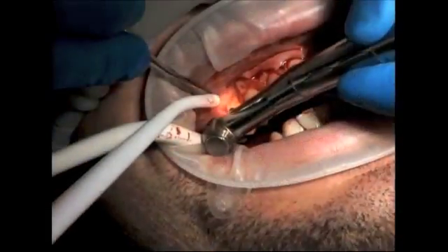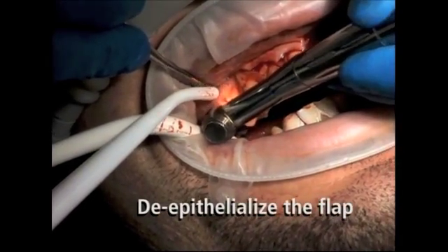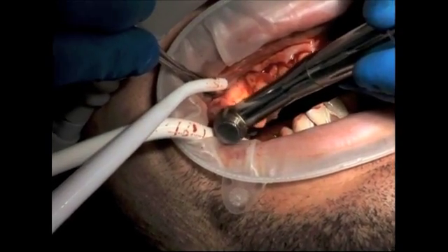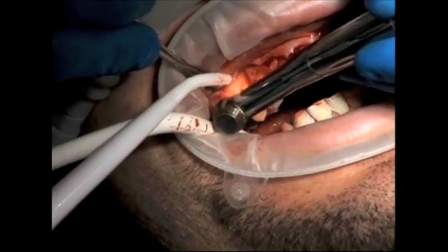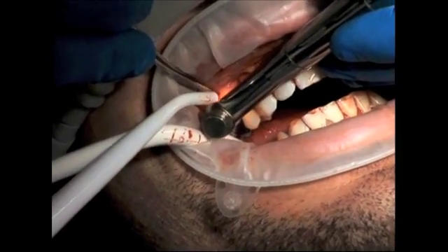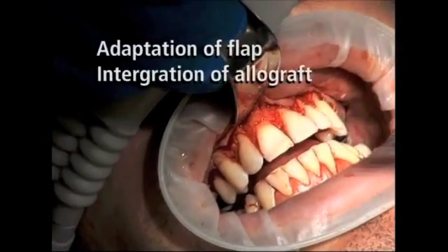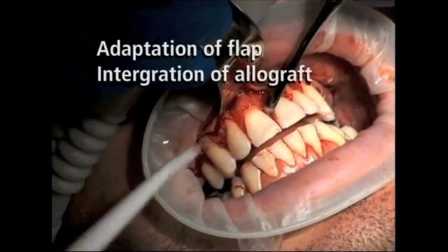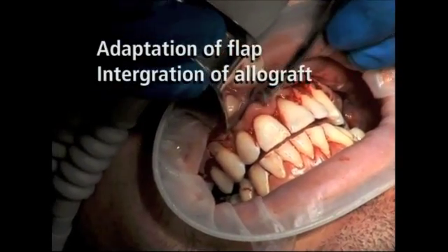Once the initial incisions are complete, a full-thickness flap is reflected to approximately 2 to 3 millimeters beyond the mucogingival junction. A round diamond burr in a high-speed handpiece is then utilized to de-epithelialize the papilla. This is important because the connective tissue side of the flap must be closely adapted to the exposed connective tissue of the papilla, not the epithelium.